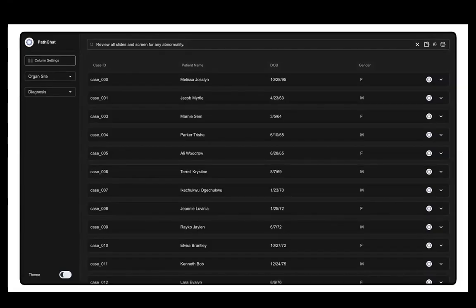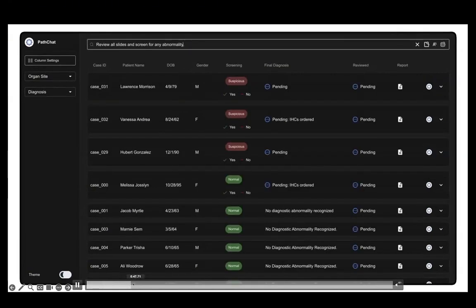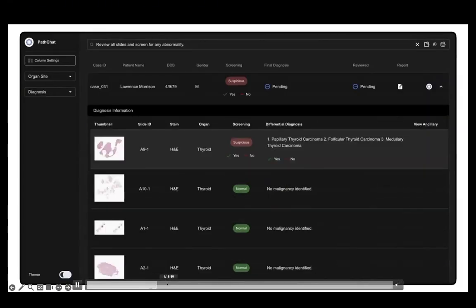So what we've done is effectively looked at the entire pathology workflow and tried to see where PathChat can effectively help. One thing you can do really well is triage out all of the negative slides. Any pathology case would have lots of positive slides, lots of negative slides. This is one large high capacity model looking through the entire slide. Can we triage out all of the negative slides and push forward no more suspicious slides?